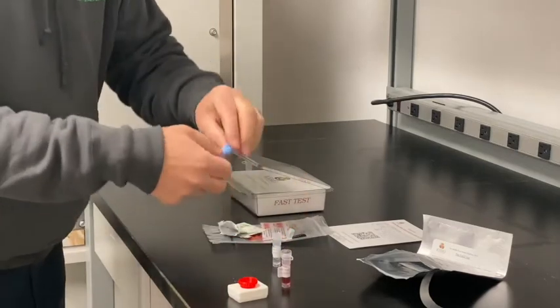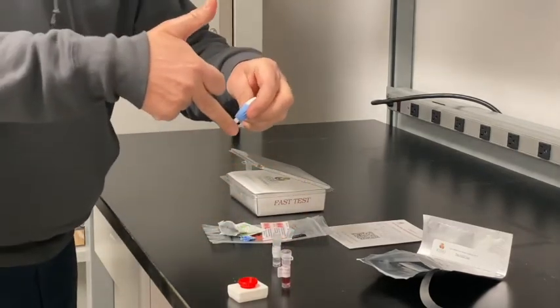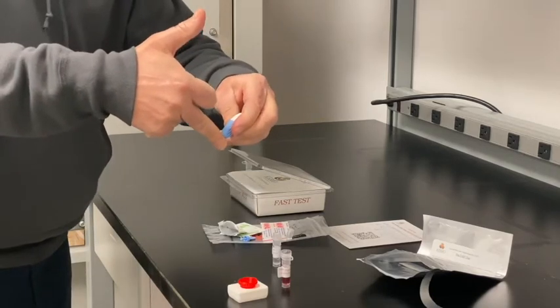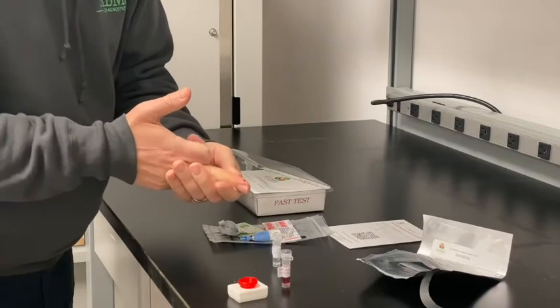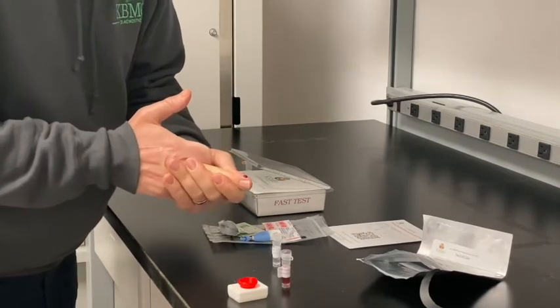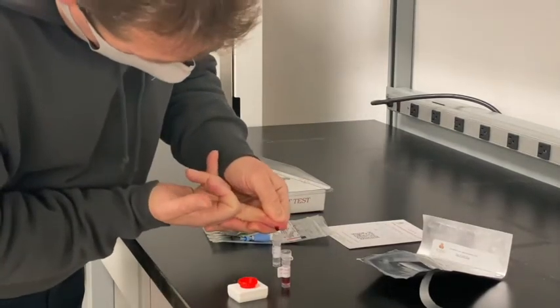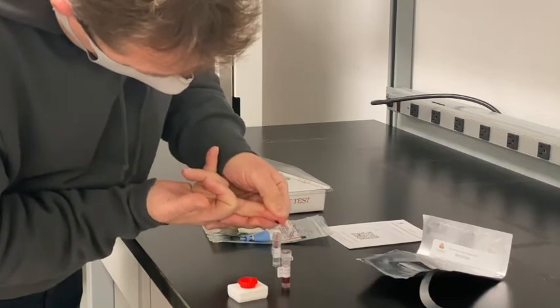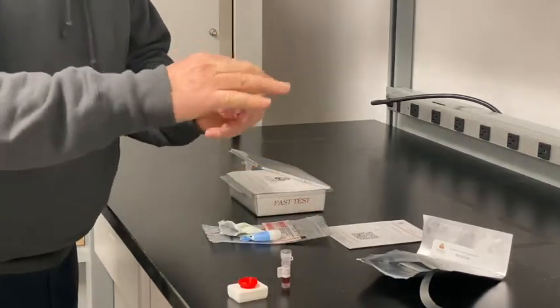Open vial 2. Then go ahead and lance the side of the finger. Keep the hand below your heart so you get good blood flow, and gently massage the finger so that you can get one free-falling drop of blood into the container, which is vial number 2. Then gently recap the vial.